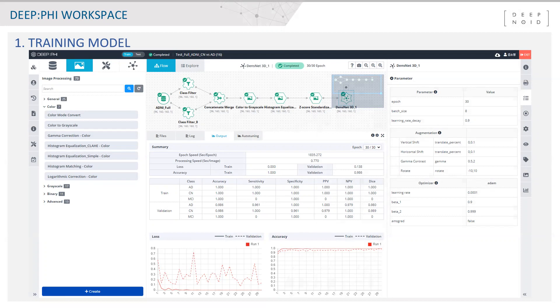On this training mode, the training dataset and validation dataset were used for model running. On the testing mode, the test dataset was used for model evaluation at the end. After the deep learning processes are completed, one can see output with prediction results for accuracy, sensitivity, specificity, positive prediction value, negative prediction value, and DICE score — which means F1 score — with loss and accuracy plots. Based on the performance output, we can see our training model works quite well.